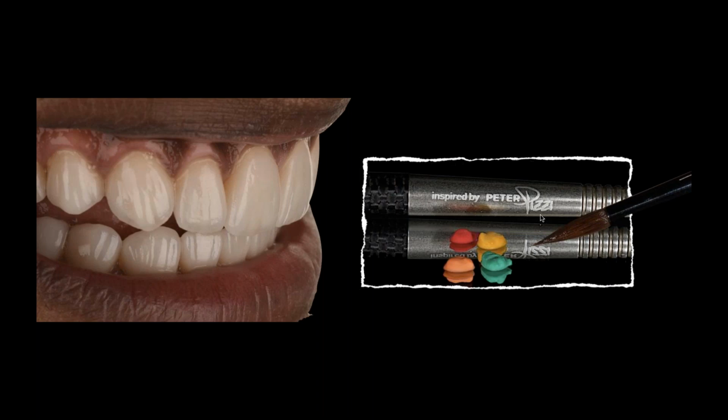All of them. So be clear that violet on the color spectrum is one of the more absorbent colors. So it tends to absorb the light wave, and that's why violet is a great area. If you look at some stains that have that violety hue to them, that's really their purpose. It's really about being able to absorb light. From a color spectrum, violet absorbs well. When do I use violet?